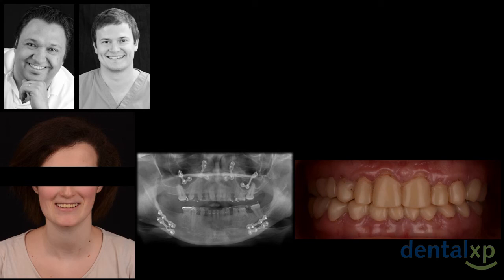I'm not really a huge fan of clinicians that use their patient name in their presentation just to give them more effect. But this case is really special for all our team. Charlene just came at her initial consultation after an orthodontic treatment. You see that she has also undergone a maxillofacial surgery. And as you can see, she got 2 full arch provisional restorations. And a dentist just referred her to a practice because after all these steps of treatment, he doesn't really know how to manage the end of treatment of Charlene.